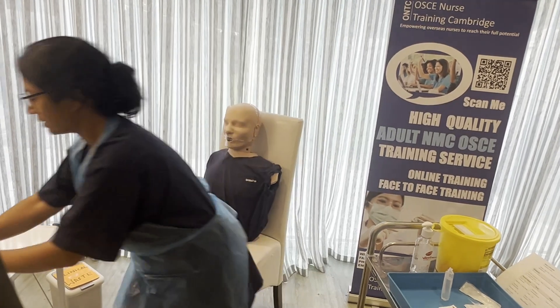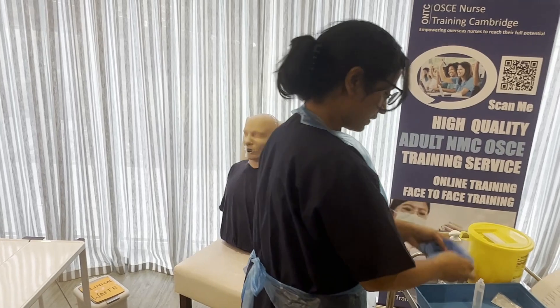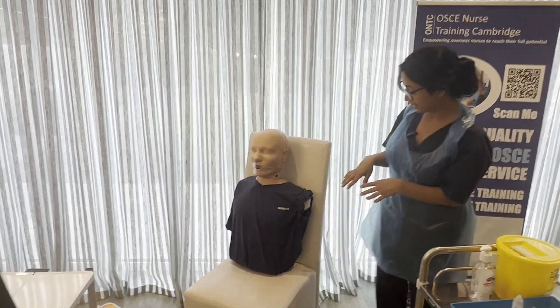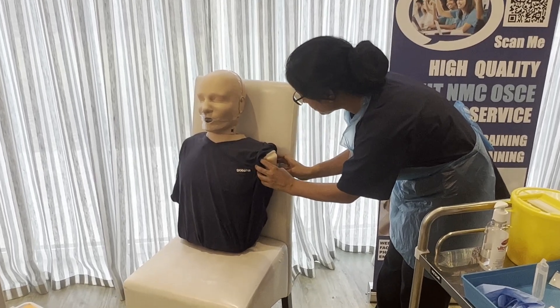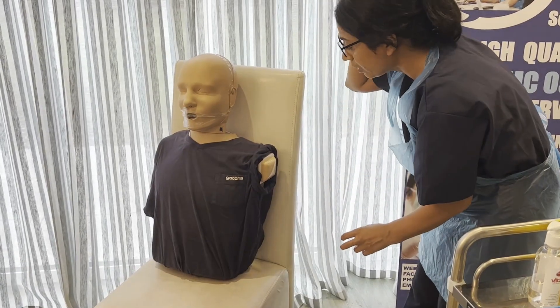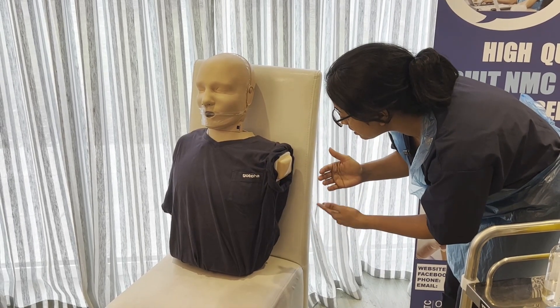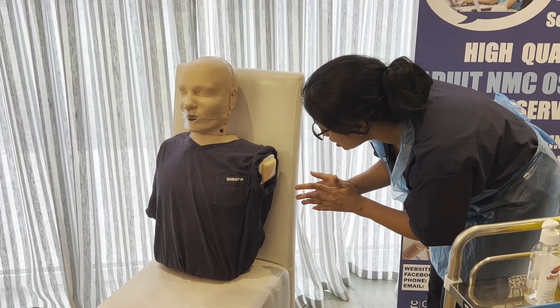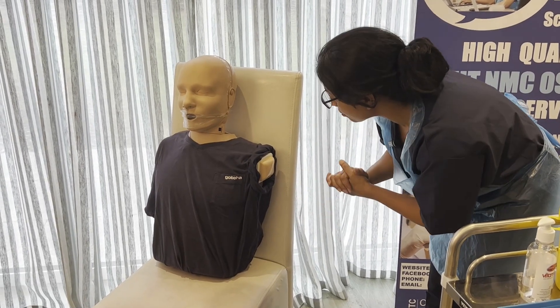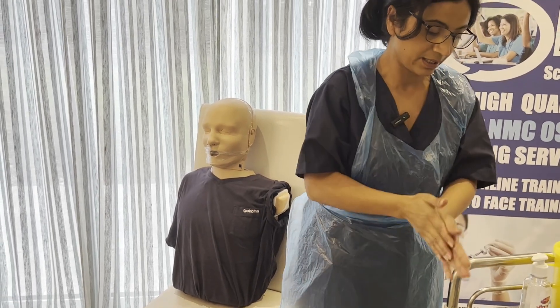We're going to change our gloves and put the used items into clinical waste, then clean my hands and apply another pair of gloves. With clean hands, before applying the new gloves, I'll inspect the injection site. The area shows no inflammation, no redness, no signs of infection, no oedema — so it's fine to give the injection there.